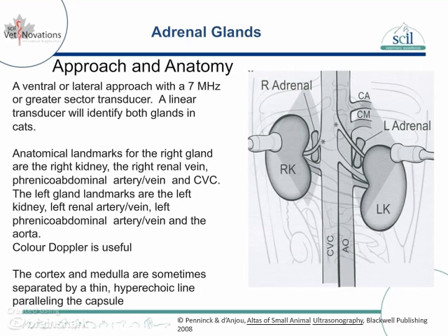The left adrenal gland is bilobed and shaped similar to a peanut, whereas the right adrenal gland may appear wedge-shaped or elongated and ovoid. The left adrenal can be imaged with the animal in dorsal or lateral recumbency depending on the operator preference, and gas or ingesta in the bowel. Scan the area medial to the left kidney to locate the renal artery and aorta.